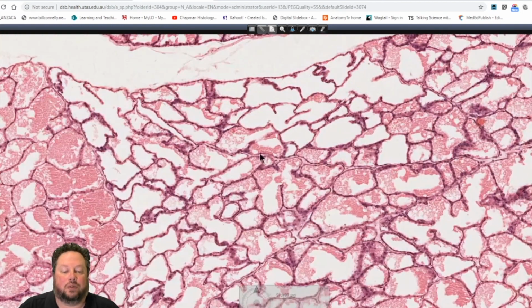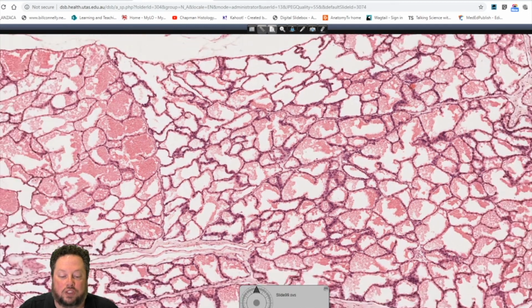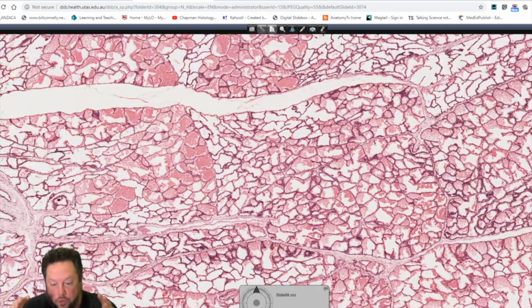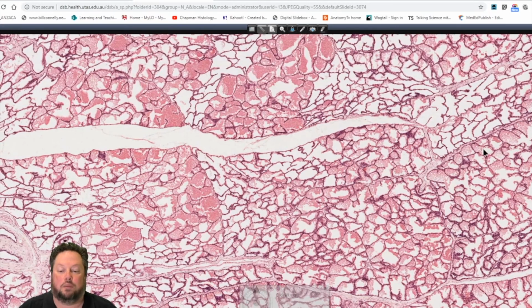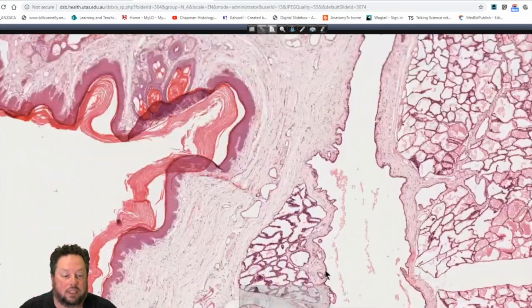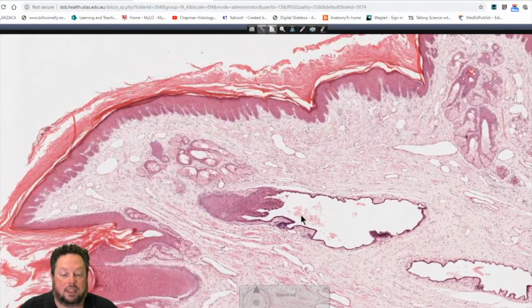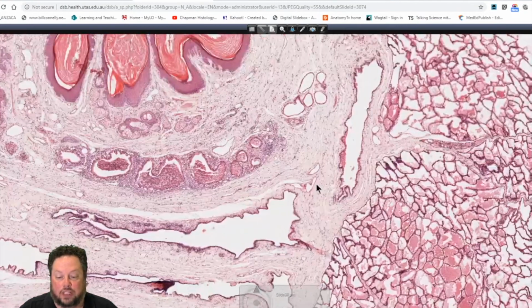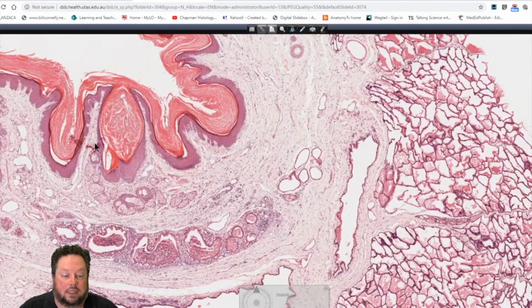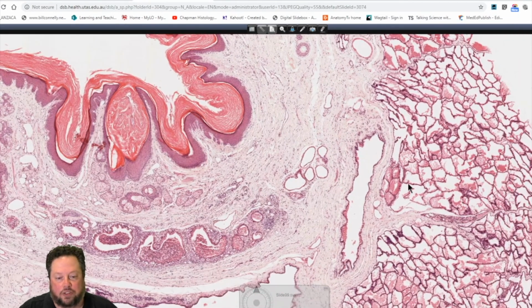And of course these cells are secretory cells. On the outside we have myoepithelial cells. Those myoepithelial cells are important and responsive to oxytocin. When we get a release of oxytocin, it causes contraction. The milk moves through the duct system. You can see the duct system here, and then eventually out through the nipple. And this is the nipple here. So you can see these large lactiferous ducts draining here. Again, we've got these nice sebaceous glands emptying directly onto the surface here.